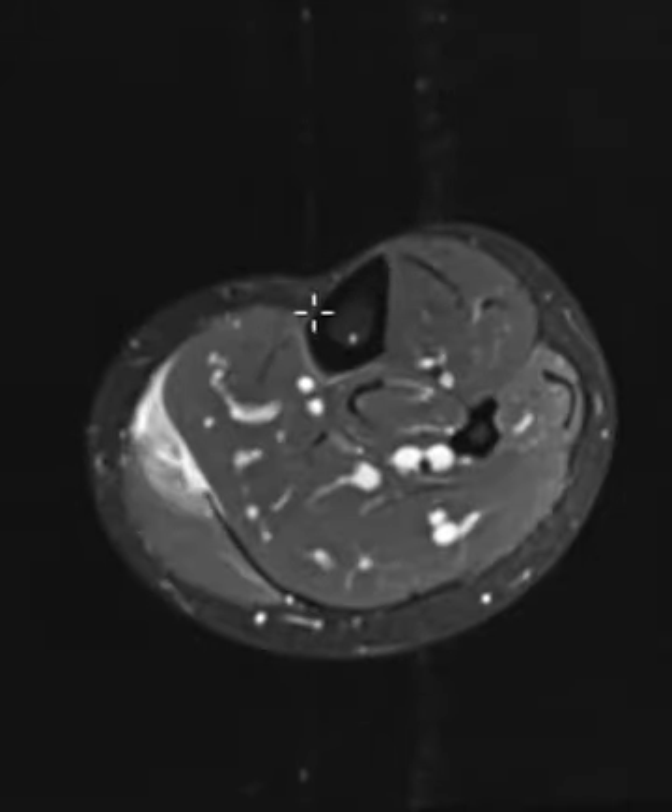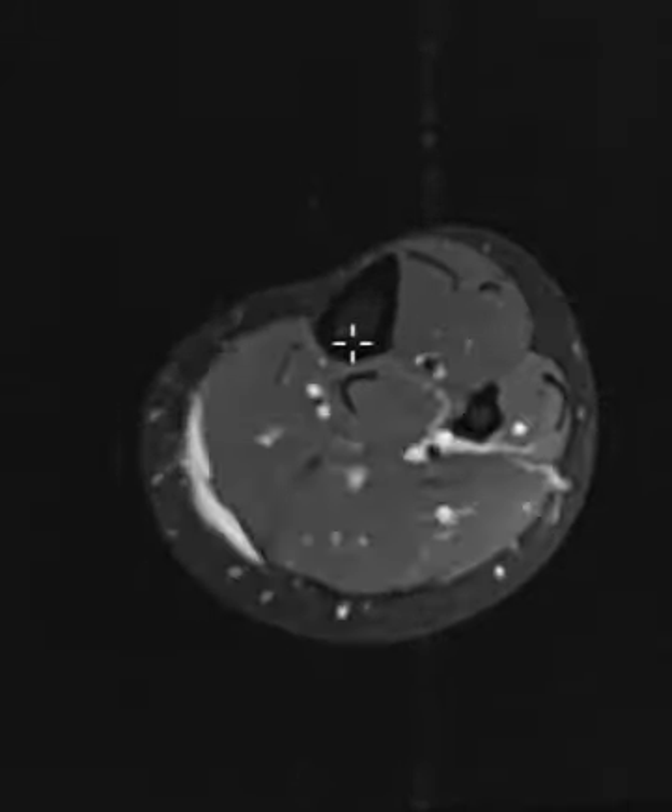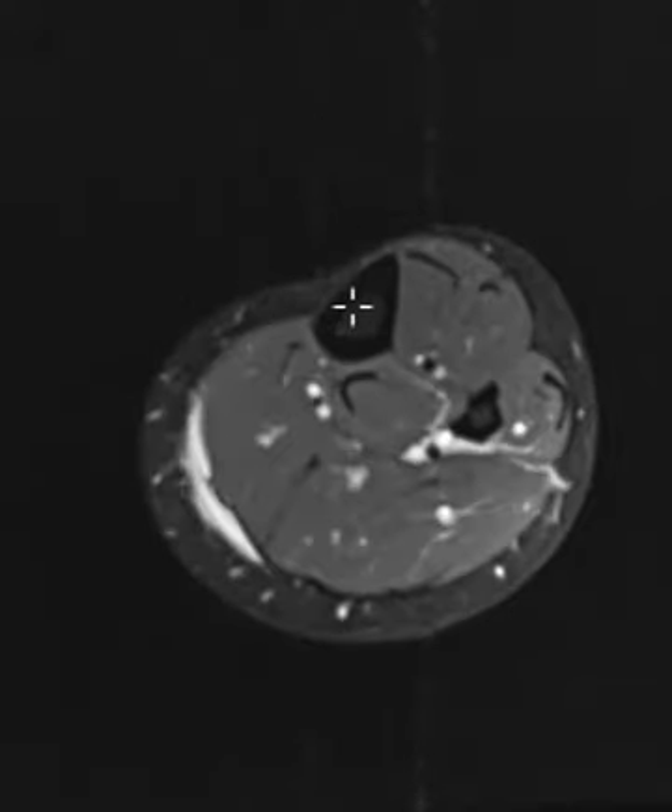What we see is the tibia is right here. It has this black cortex and the gray marrow. It looks totally normal. There's no tibial fracture, no stress fracture, no shin splints, no edema or periostasis along the front of it, so it just looks absolutely normal.